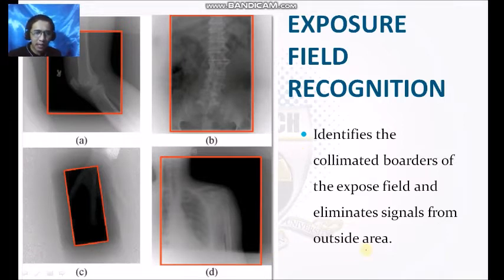No? It can be, like for example, one of the advantages when it comes to computed and digital radiography, even if the computer system or the monitor will display all of this image, since you are dealing with a computerized image, we can actually have it cropped. No, pwede nato na siya i-crop. Similar sa gapang buhaton niyo sa inyong mga pictures, no? When it comes to your mga selfie ninyo, mga groupie ninyo, diba? You can crop the images. You can have a wide picture, but then you can crop it so that the picture will become smaller. So parts of the picture will not be displayed.